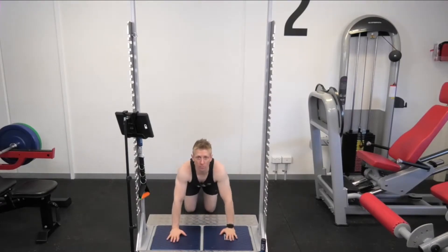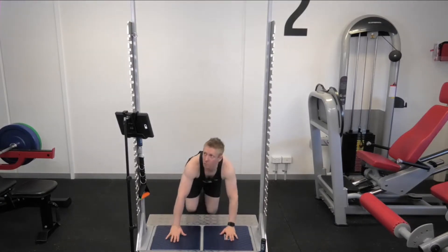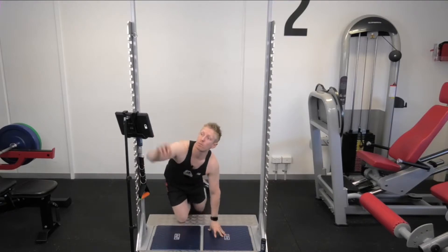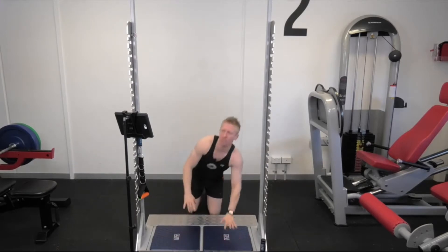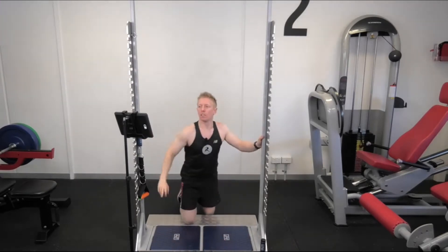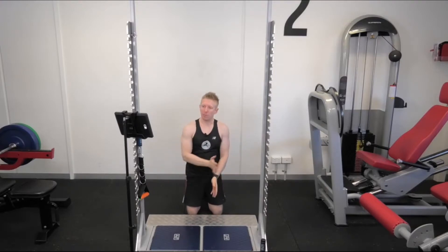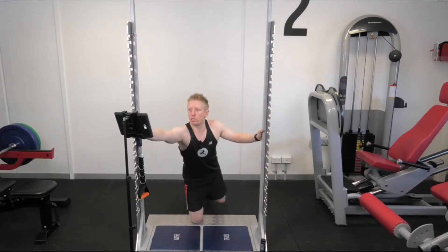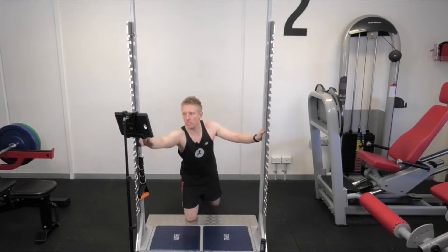To do the max velocity push-up test, I'm going to adopt the normal push-up position and do three as fast as I can. That tells me that I'm putting about 10% more force through the left side, and I'm generating the force pretty similarly side to side. Let's have a look at the next test.